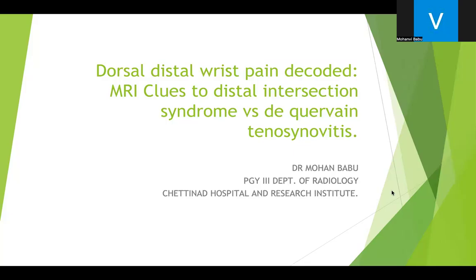Recording in progress. Myself, Dr. Mohan Babu, third year resident in the Department of Radiology, Chettinad Medical College and Research Institute. The topic is dorsal distal wrist pain decoded: MRI clues to distal intersection syndrome versus de Quervain tenosynovitis.